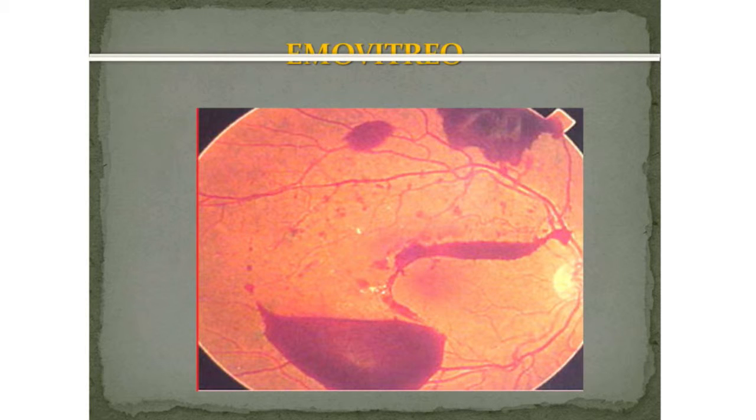The vitreous should be transparent to allow for the entrance of the light. It is blurred by blood instead. And here you see hemorrhage, and the macula by itself doesn't seem to be so highly altered, and the picture by itself can be tricky.